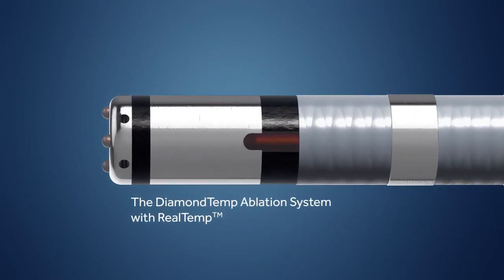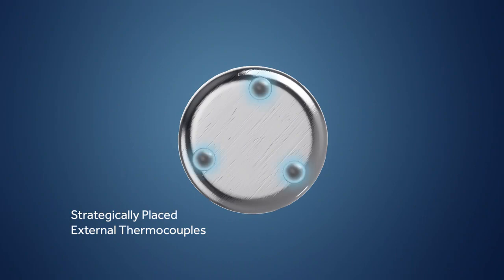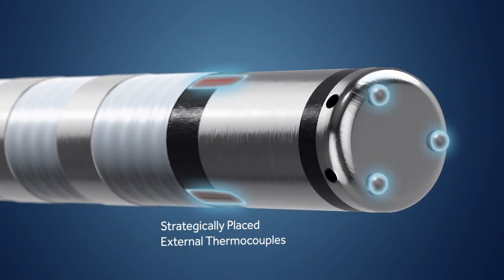Realtemp enables customized intelligent lesion creation through real-time feedback of interconnected biophysical parameters. Realtemp technology uses strategically placed external thermocouples to measure temperature and modulate power during RF ablation.